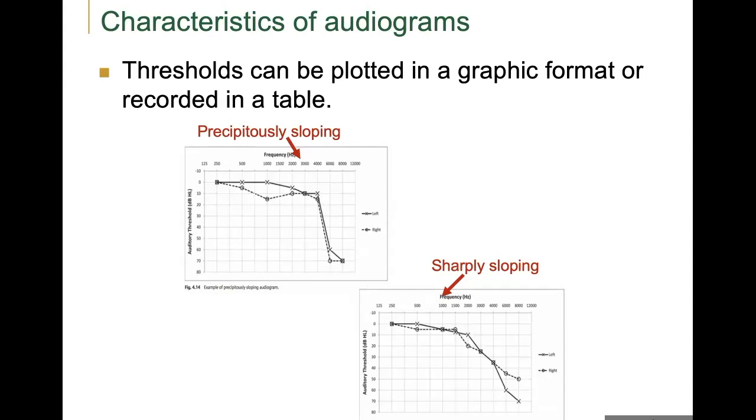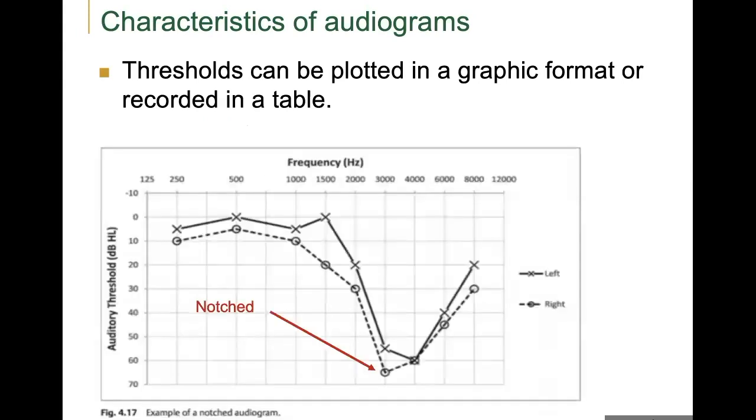And if we're talking about a child who's exposed to loud sounds or who is listening to the music too loud, we might also see some small noise notches. So I'm talking like real small. So they might have normal hearing from, I don't know, 250 to 3,000 hertz. But then when you get to 4,000 hertz, they've got just like 35, 30, right? So you need to be looking for that, because that's yeah, it's one frequency and it's only a mild kind of loss there.